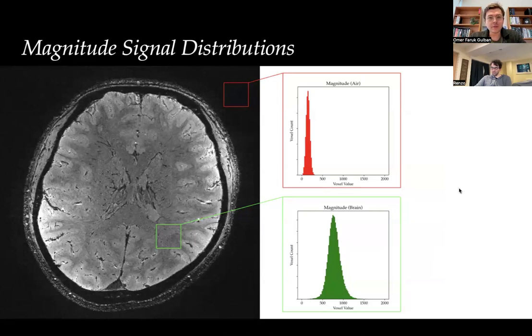So, okay, just a side note, because I do believe that there is a value to consider phase jolt over phase Laplacian from a geometric and voxel statistics point of view. And it is this one. Here I am showing you a high SNR 0.35 millimeter isotropic anatomical image that is acquired at 7T. The details are not so important. But here I am just showing you the signal population characteristics over an air area and the white matter area, just pure tissue, to represent very low SNR and very high SNR regions of the image.